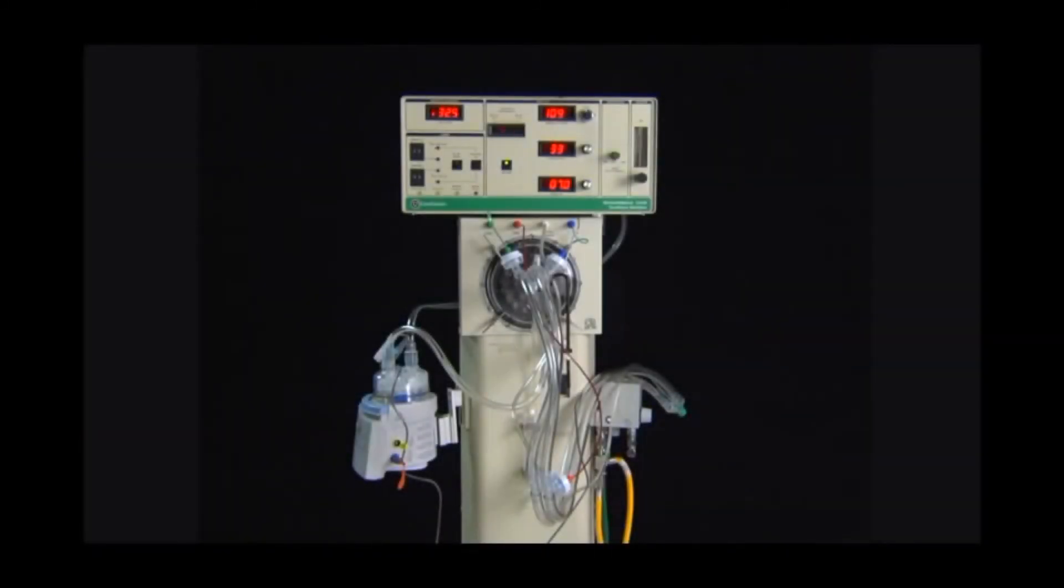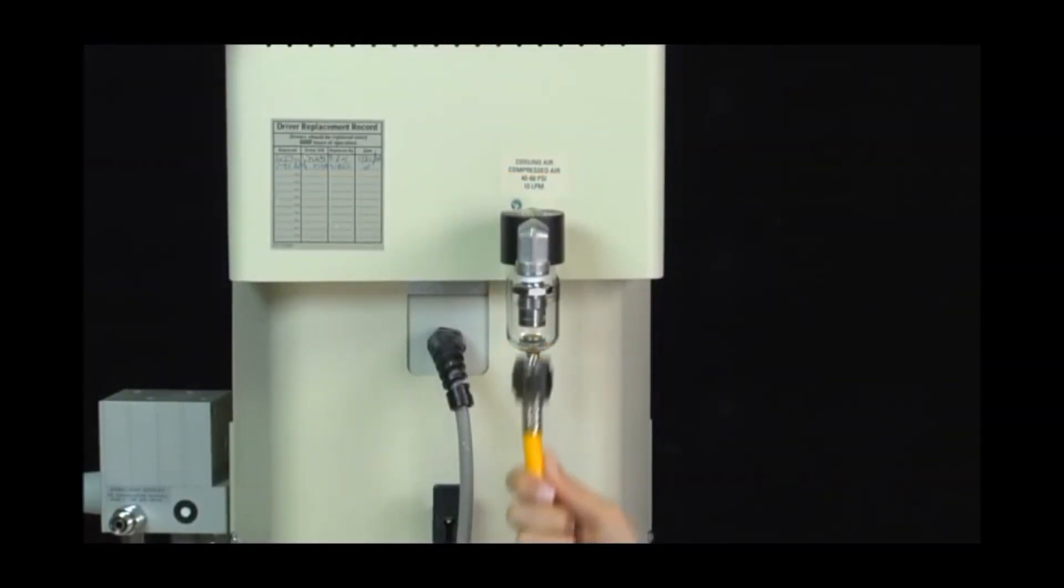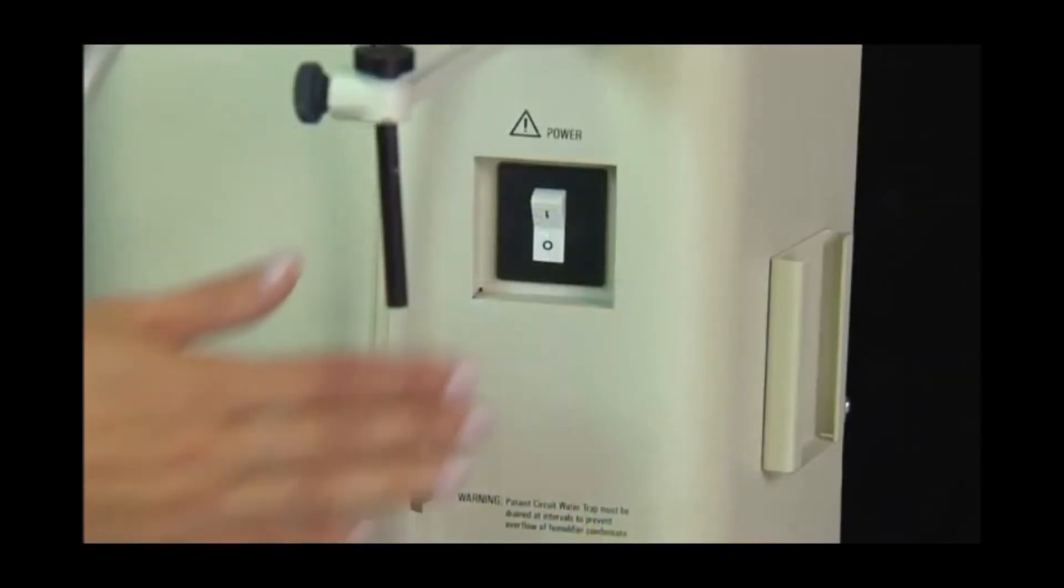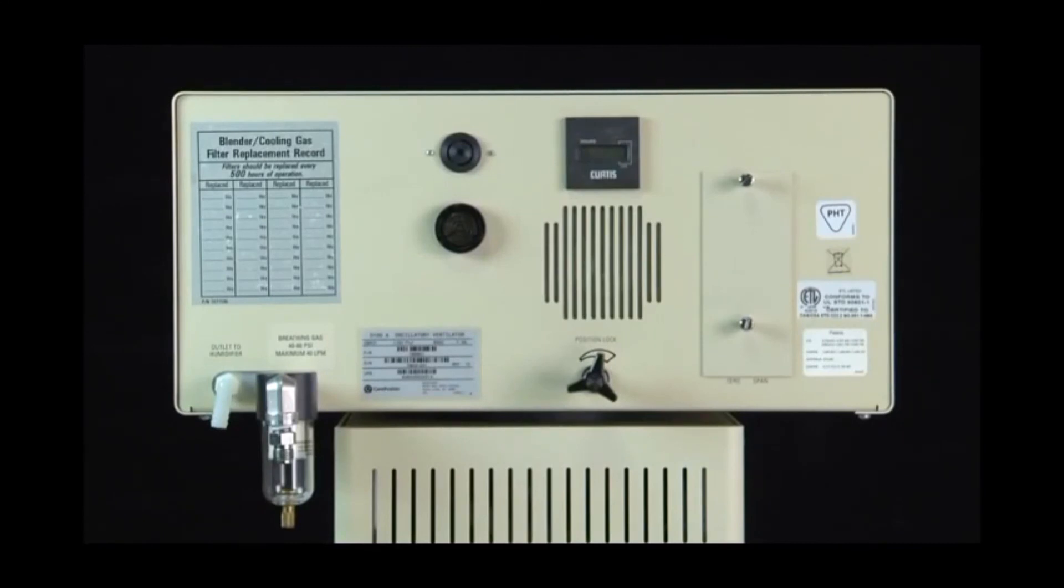The 3100B high-frequency oscillatory ventilator is now ready for the operational verification and startup procedure. The operational verification and startup procedure must be performed before using the ventilator. If the 3100B fails any part of this procedure, contact CareFusion Technical Support. Connect all source gases to the ventilator and turn on the main power switch. Ensure that the stopcock to the water trap is closed and the cooling fan at the rear of the driver enclosure is operational and clear of obstruction.